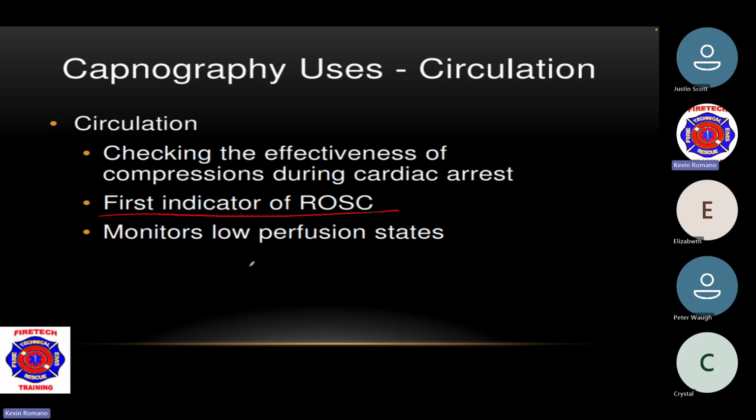So again, some other indicators. I'm not saying that if you have a reading of 5, you just call it in the field and say we're not going to work this cardiac arrest. It's just other indicators to help state your cases with it.